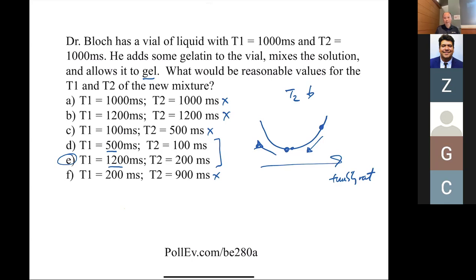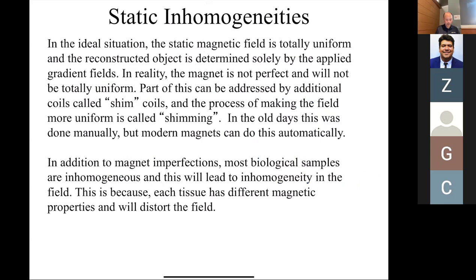All right, so that's all we're going to talk about for T1 and T2s. And then the next thing we're talking about, which is a really interesting part of MR, is going to lead to functional MRI. The two things we're really leading up to are understanding the spin echo, which is like bread and butter, and then functional MRI. So that's what this is going to lead to. Okay.